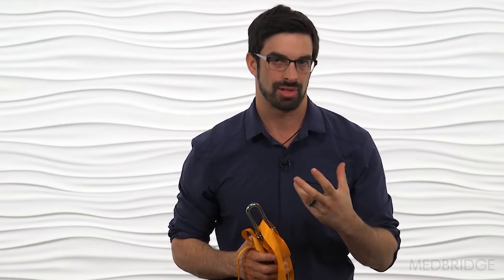Right now I'm going to show you how to set this up for an athlete. You can do this for any muscle in any testing position, but we're going to specifically demonstrate it for the middle trapezius muscle of the scapula.